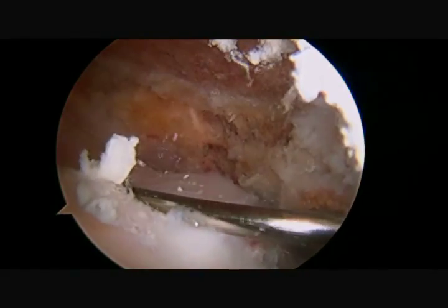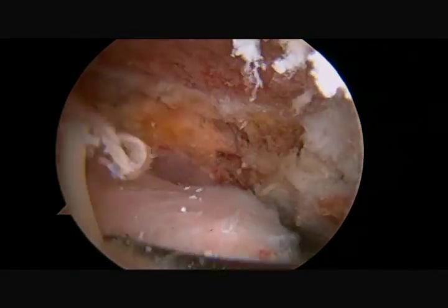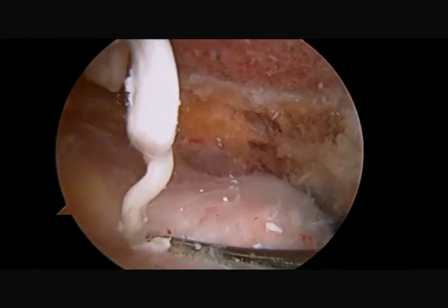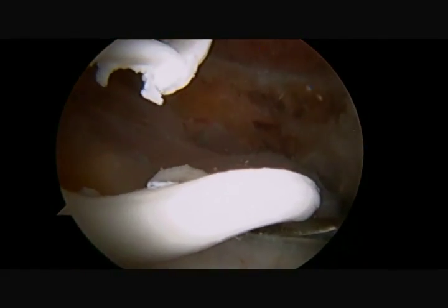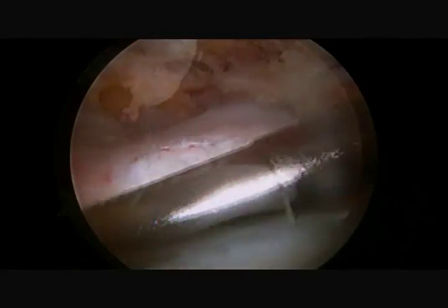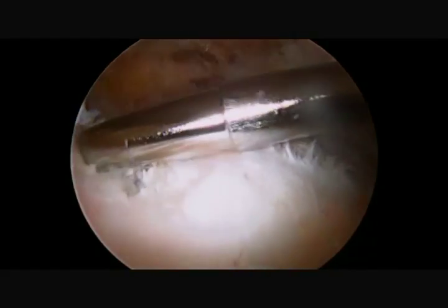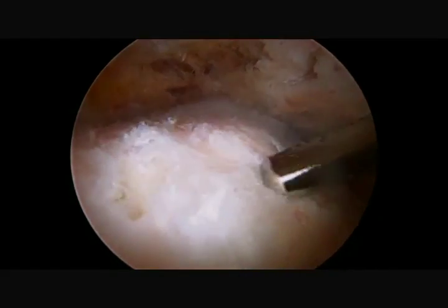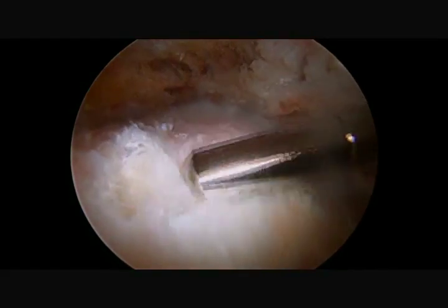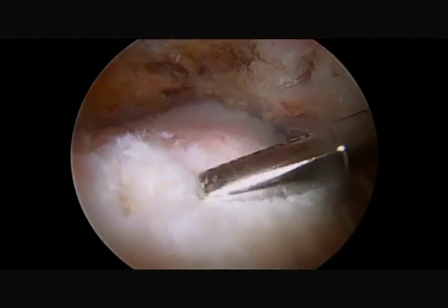The rotator cuff is probed and the area of calcific tendonitis is identified and decompressed. The calcific debris often has the consistency of toothpaste, as you can clearly see in this video. This is an extremely large deposit, as we could see on the initial x-ray.